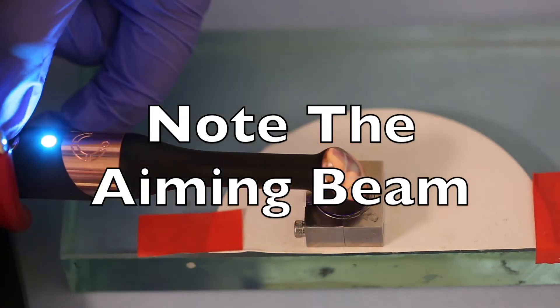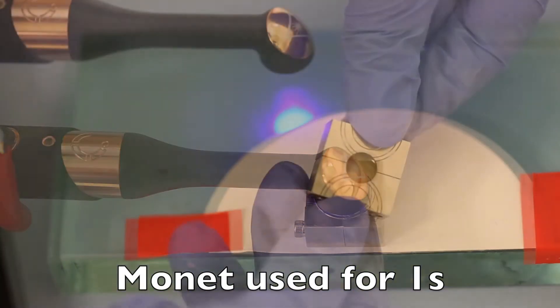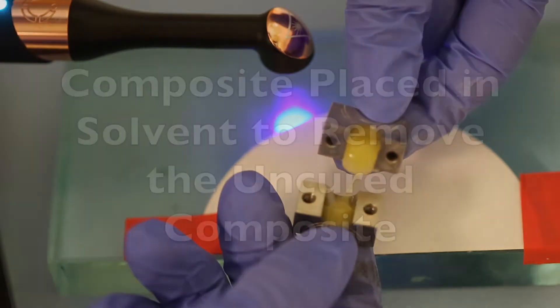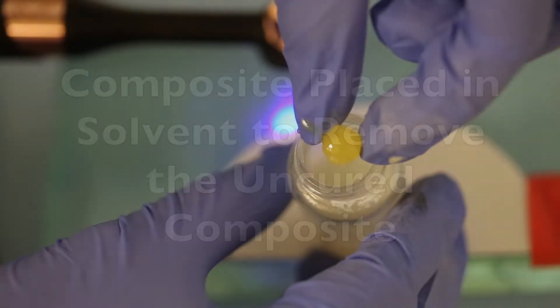Now we're going to cure it for 1 second. Wow, that's fast. When we open the mold, we see unfortunately it's not cured at the bottom. We put the composite into a solvent to remove the uncured composite.